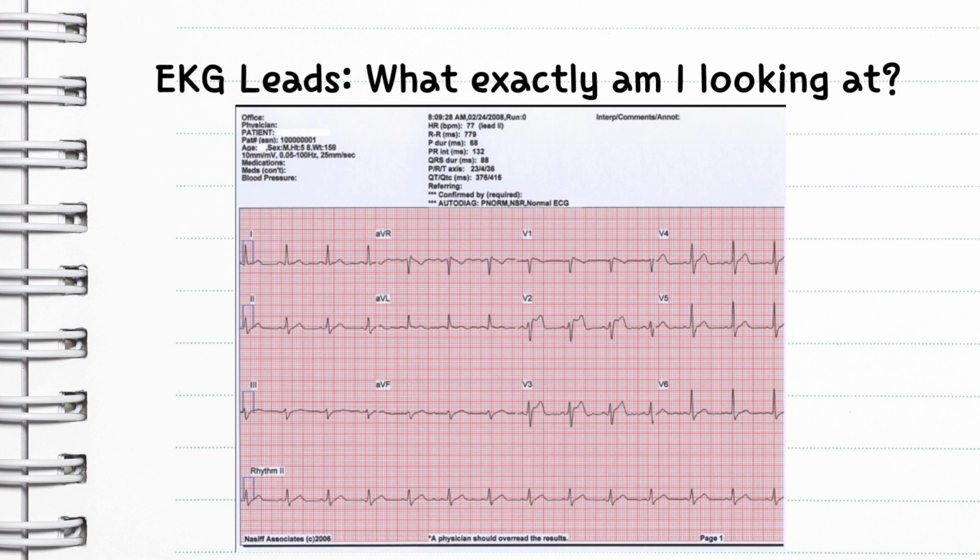Yes, it does measure stuff at the top for you, which is very nice, so that you don't have to do it old school style with calipers. And a lot of times it will have interpretations up there. It will say like acute STEMI or sinus brady. It kind of interprets the EKG for you, but don't always trust that. You always get a physician. As soon as you get these done, a physician needs to see it, review it, an expert to basically identify if there's anything life-threatening on it or not.